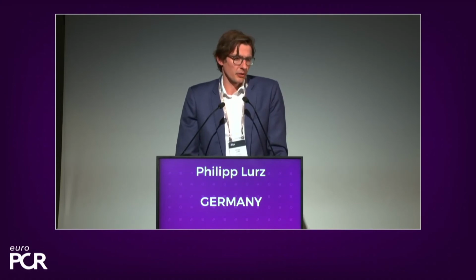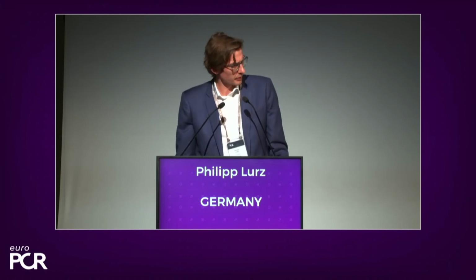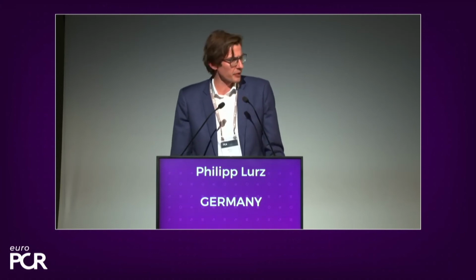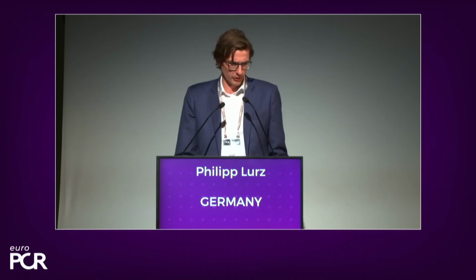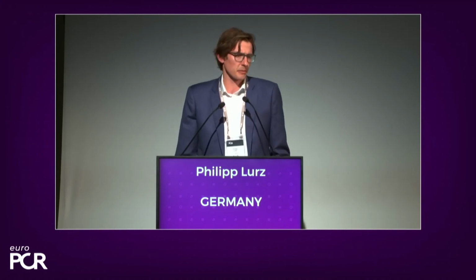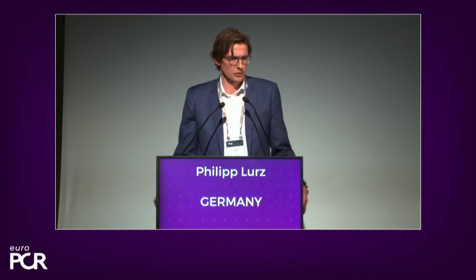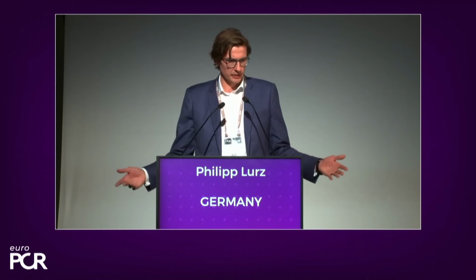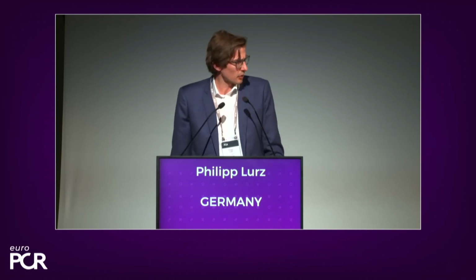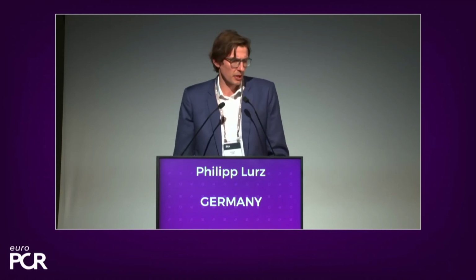And if you're in doubt, as demonstrated and also discussed, reopen the device because it will help you to understand what you've done and what you potentially could do better. And there's absolutely no risk with that device. If you just open the pedals, you still have the clasps down, the leaflets will stay in place. There's no risk of losing them, and there's also no harm to the leaflets.